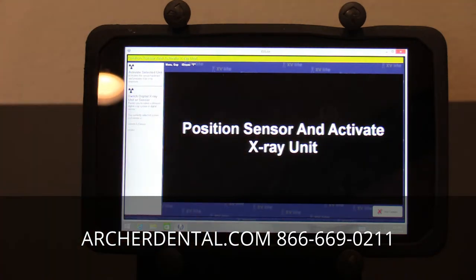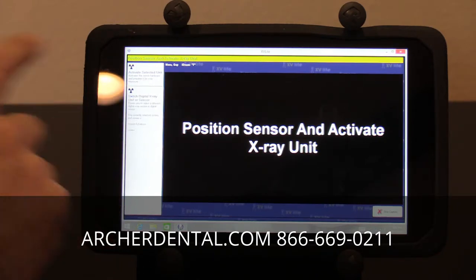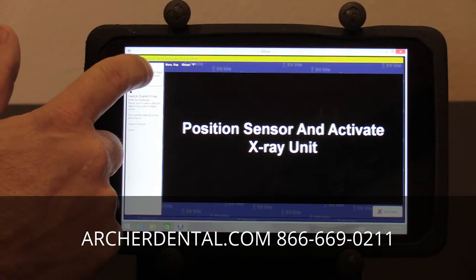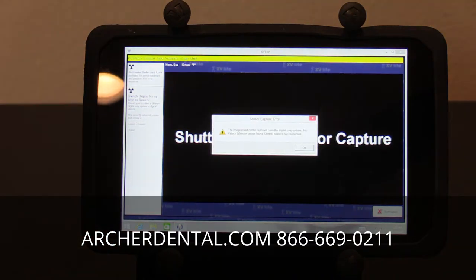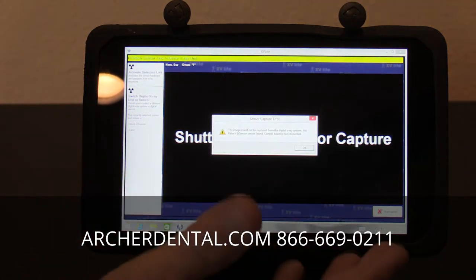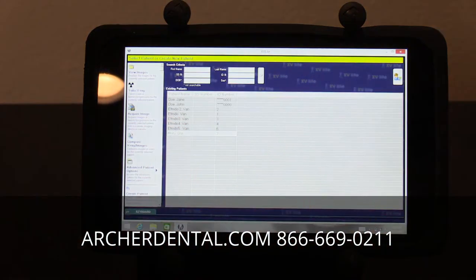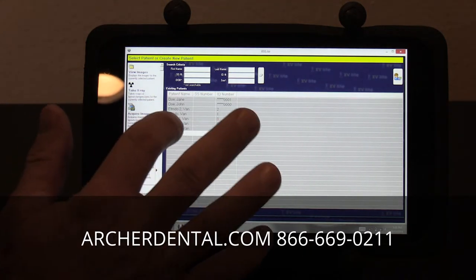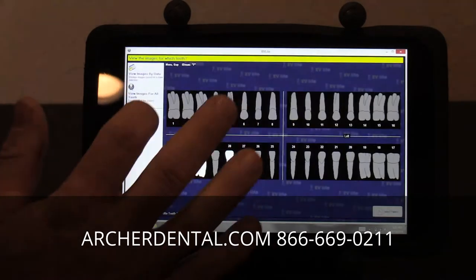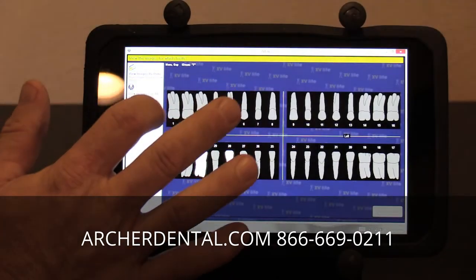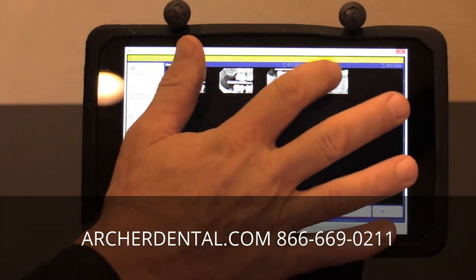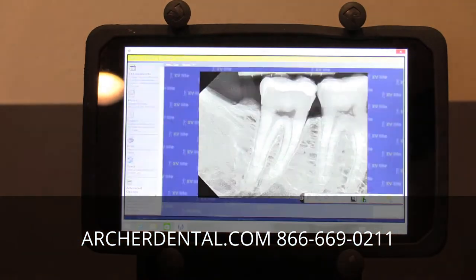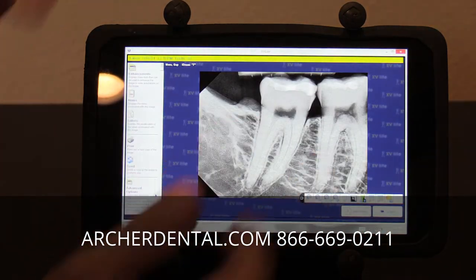Since we don't have a sensor plugged in, it won't activate — but I'll show you what it does just in case. It will tell you 'sensor failure' because there's no sensor plugged in. Otherwise, it would allow you to take the image and you would have an image pop up on the screen like this.